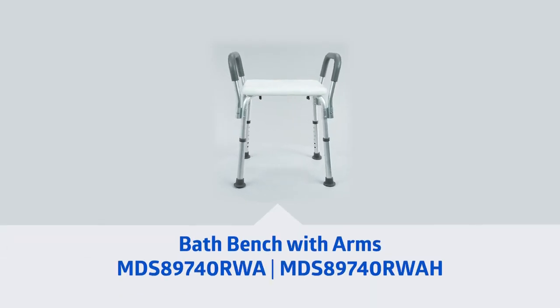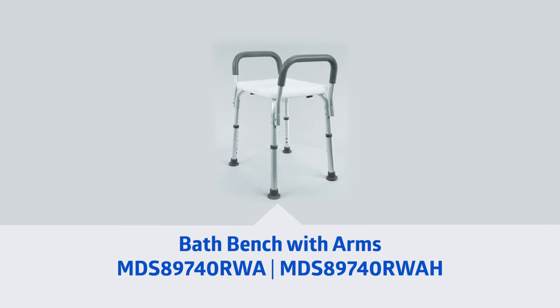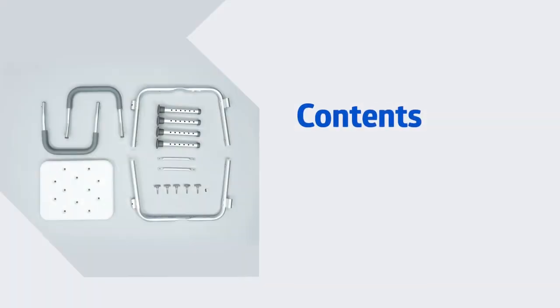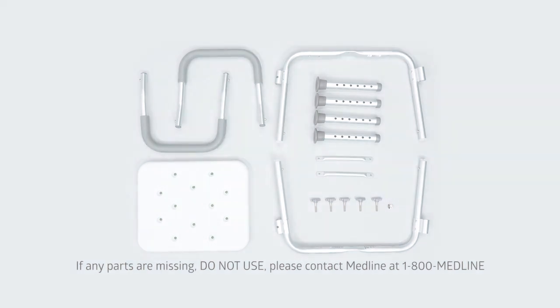Thank you for taking the time to watch this video on Medline's bath bench with arms. This segment is going to go through your bath bench contents. Ensure that you have all the necessary components before assembling your bath bench. If any parts are missing, do not use. Please contact Medline at 1-800-MEDLINE.